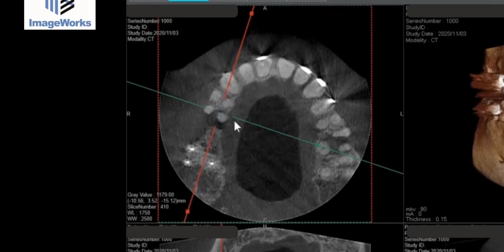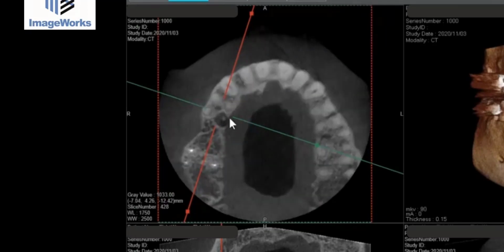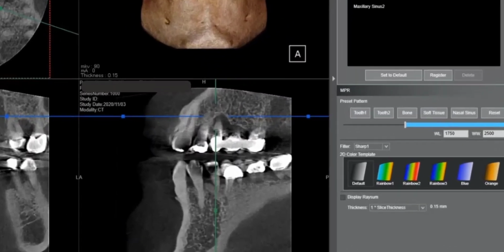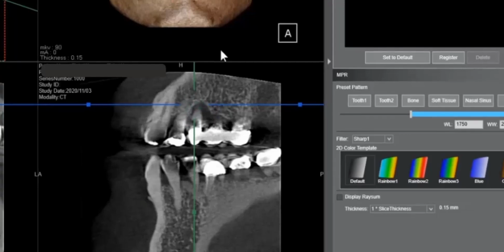It had blown out around the palatal root and blew out the palatal aspect. This palatal wall is all blown out. So we had to section the bridge, take this all out, and then rebuild this ridge and rebuild the palatal part of the defect here. Since I was there, I had to build up this area also in case we're going to put an implant in there. So this whole area has been built up now and it's just healing.